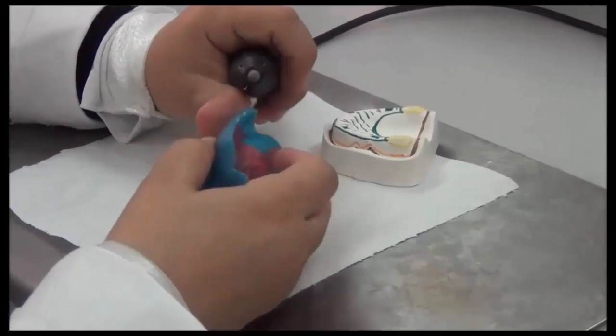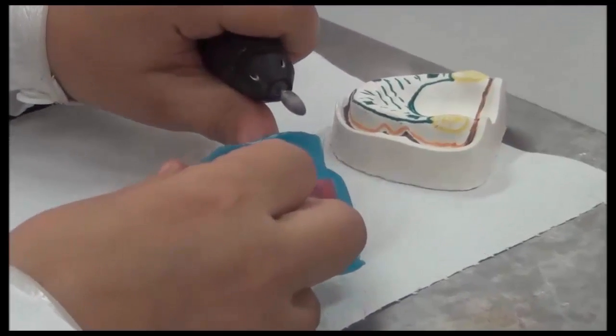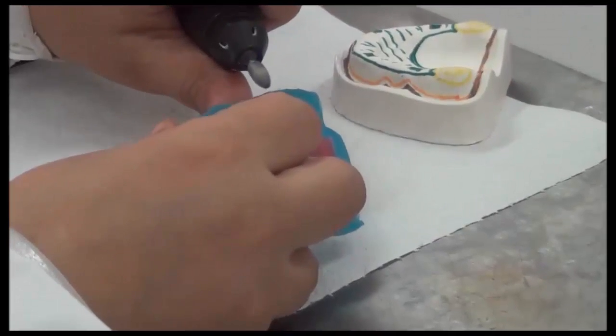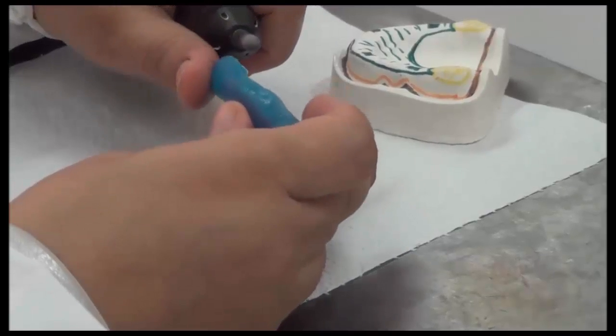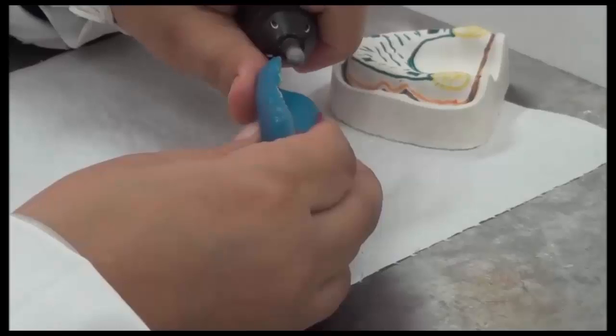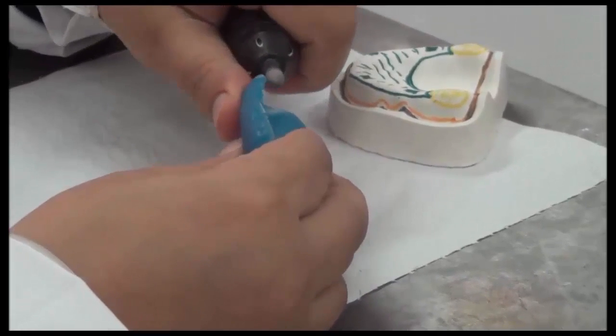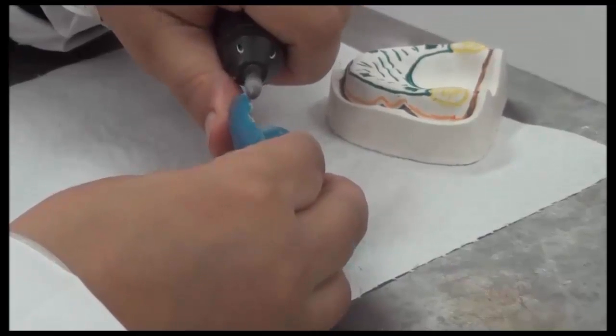So we need to work with the cast. If I'm doing a border, we don't point with the burr onto the surface. We put the full length of the burr on the surface. So this is the full length of the burr, and I'm simply running over the border just to remove sharp areas.